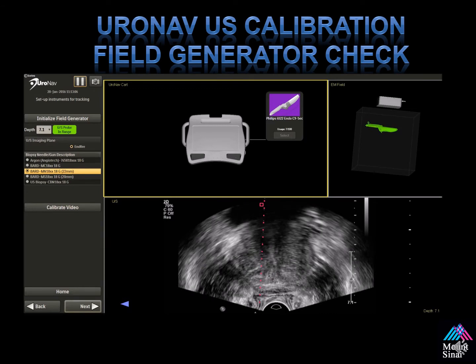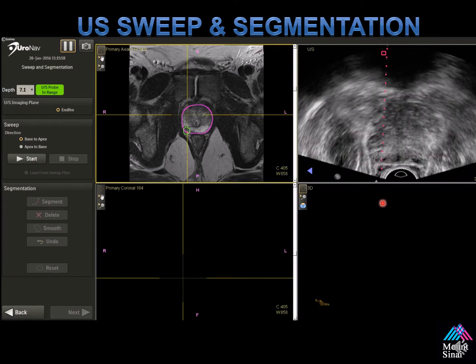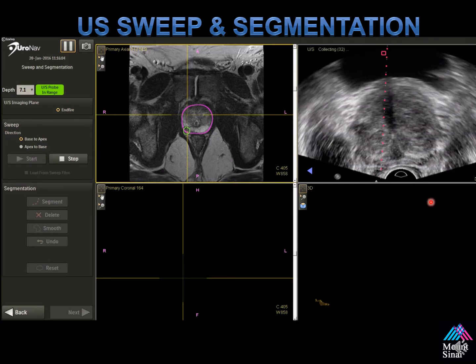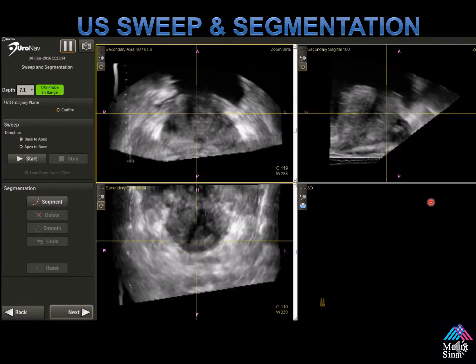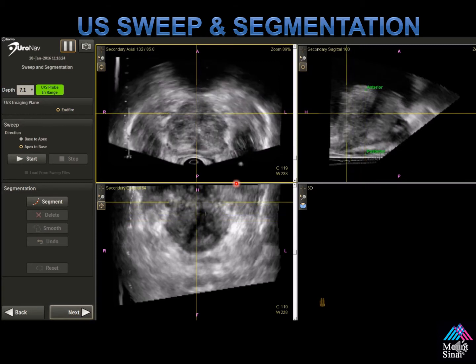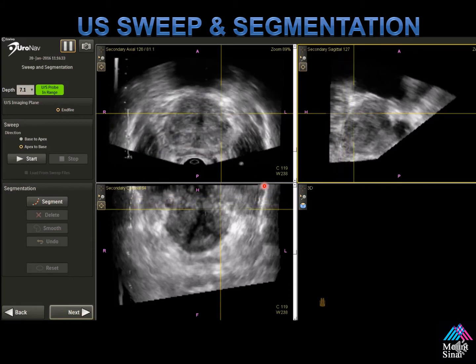Once you've completed the setup, the next and most important step is the ultrasound sweep, shown in the upper right. I sweep from the apex to the base in a slow, even fashion — you need to go at the same pace because the computer doesn't recognize how fast the probe moves. Then you're able to review the transverse images that are created. We mark the right, left, anterior, and posterior of the prostate to help the computer with segmentation. If you don't click the apex-to-base sweep button correctly, the apex will appear in the wrong location — it's important to understand what happens if you don't click the button in the same direction you make your sweep.